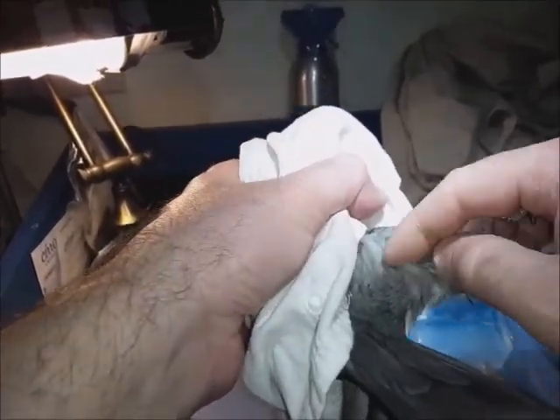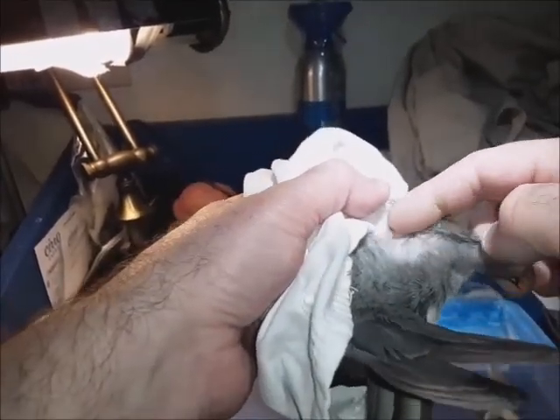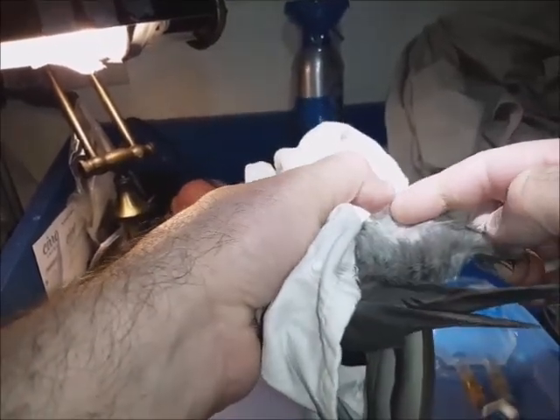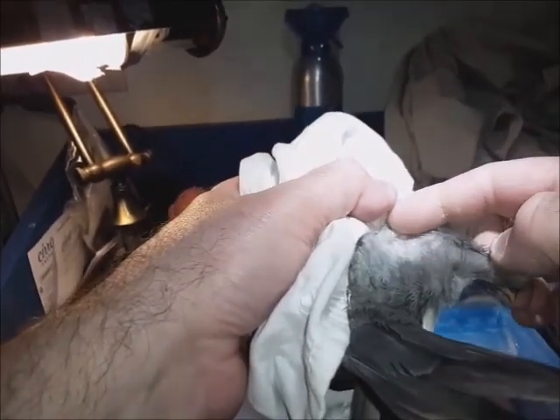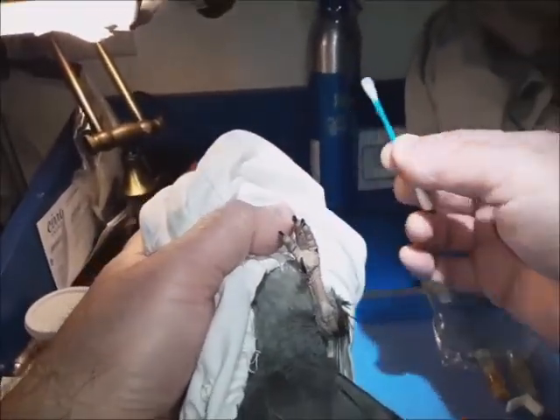If the feathers are dry, they may still get in the way too much. When you're trying to put the needle in, you have to be able to see the bare skin to make sure that you get the needle at the proper depth and that the medicine goes in. So what I do is wet the feathers with a cotton swab.